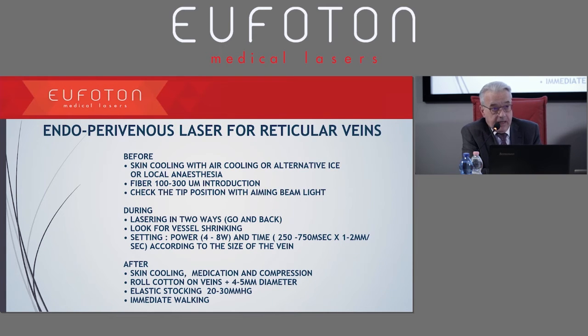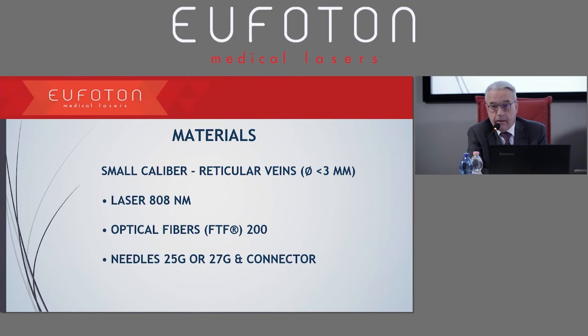After the treatment, it's not very unlike a sclerotherapy, with a compression. We apply a moisturizing cream, compression, elastic stocking, considering the chronic disease, and immediate walking.